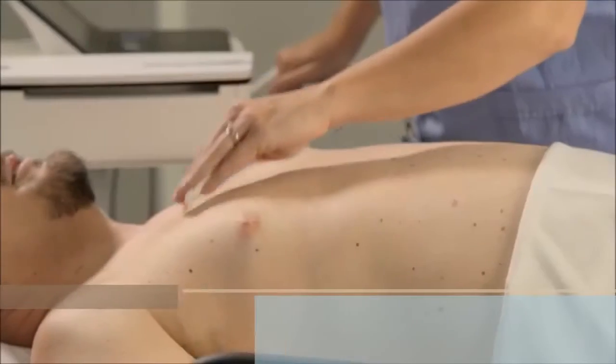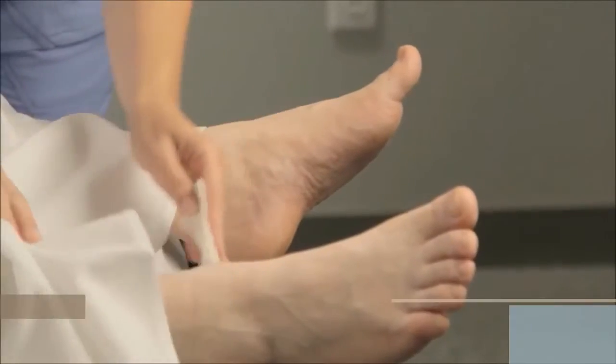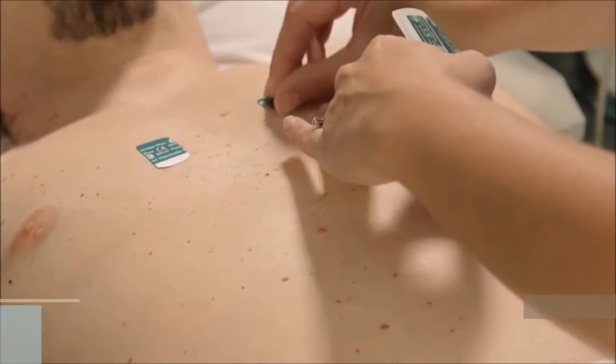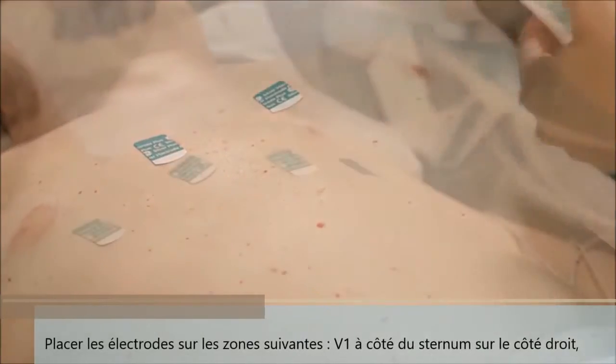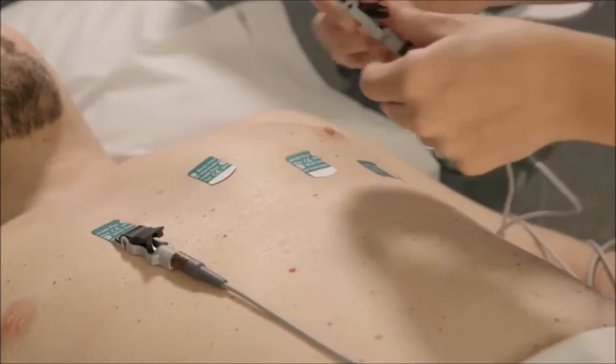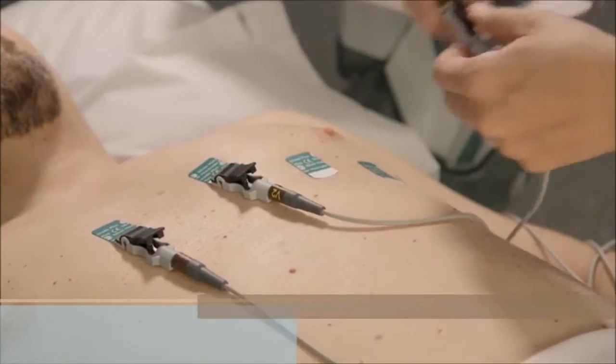Prior to placing leads, patient body hair must be removed to assure good contact. After hair removal, abrade the skin and cleanse with alcohol, then dry completely. Place the electrodes in the following areas. V1 next to the sternum on the right side. V2 next to the sternum on the left side, both at the fourth intercostal space.